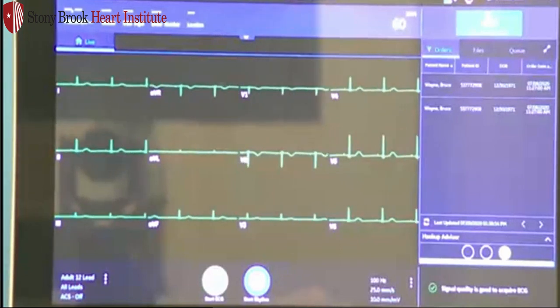To the right of that will be your Wi-Fi signal. The carts will transmit wirelessly, and just like your cell phone, if you notice that you're not having any Wi-Fi signal, you may need to move the cart around based on your network.